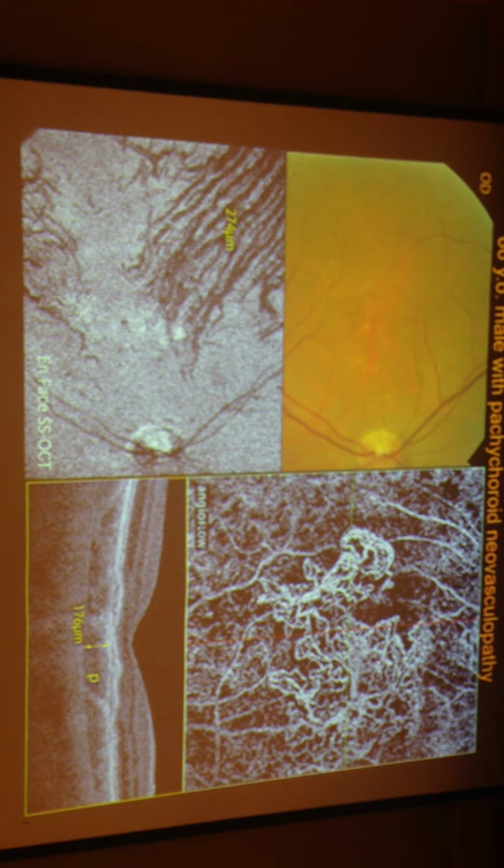Yes, exactly. And the other question, about the reason for focal choroidal vessels being dilated, well, nobody really knows. I think it's part of the anatomy, sometimes. And we all know that in myopic patients with very, very thin choroids, they have very dilated choroidal vessels, and that's something that we've been trying to look at to see why. It could be a compensatory mechanism because they have very thin choroids, so they have dilated choroidal vessels to perfuse the retina.